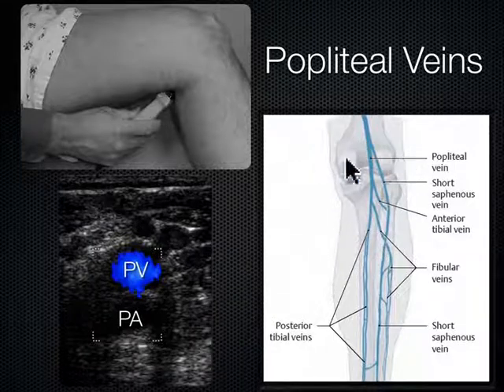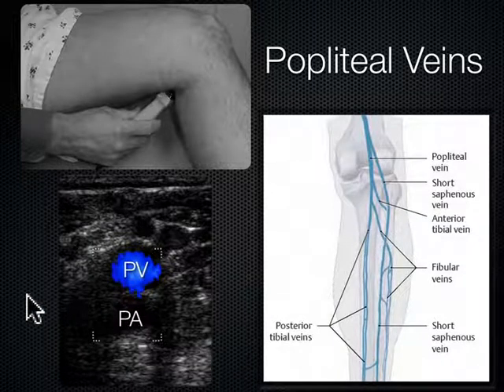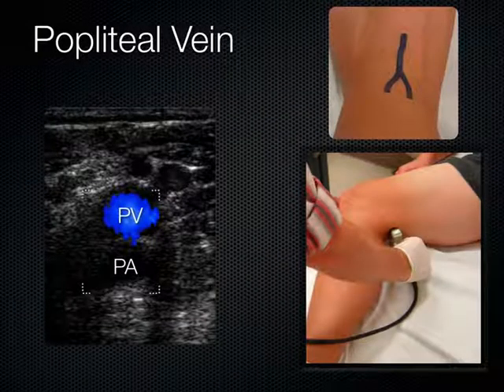we're really concerned with this popliteal region. And so here's the popliteal vein, here's the popliteal artery. The vein comes to the top in the pop. That's how you can remember that. And again, it's this sort of bifurcation that occurs. That's sort of the area that you're going to be looking at.